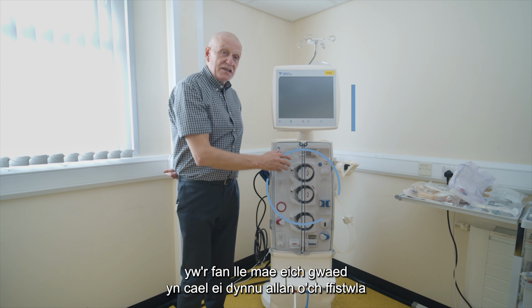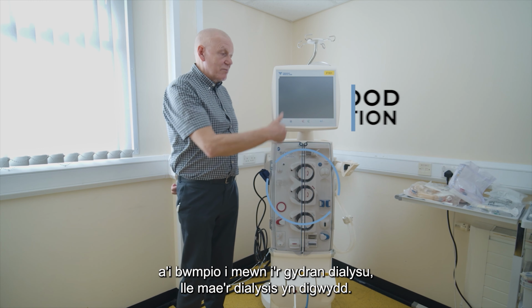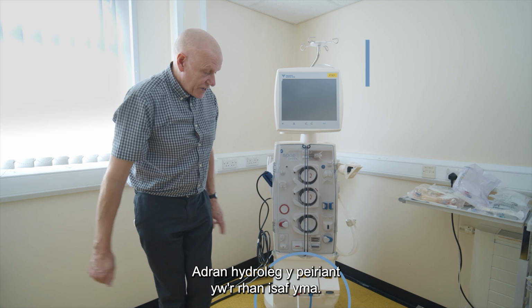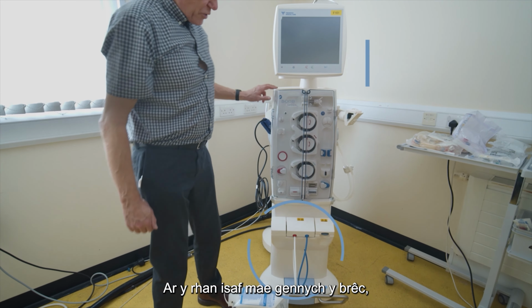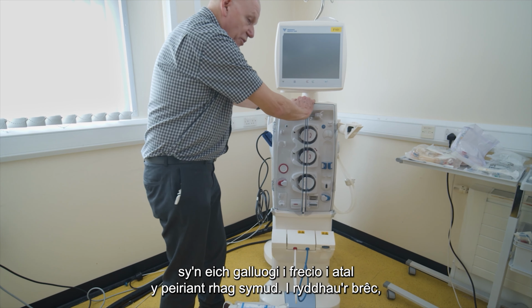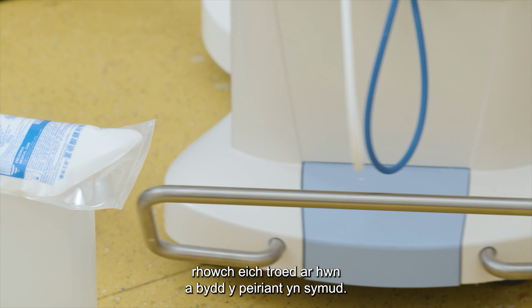The blood section is where your blood gets taken out of your fistula and pumped to the dialyzer where your dialysis takes place. The hydraulic section of the machine is the lower part here. On the lower part, you have the brake, which allows you to brake the machine to stop it moving. To release the brake, just put your foot on that and the machine will move.